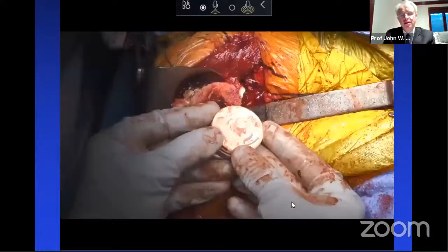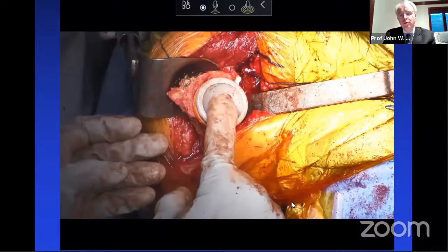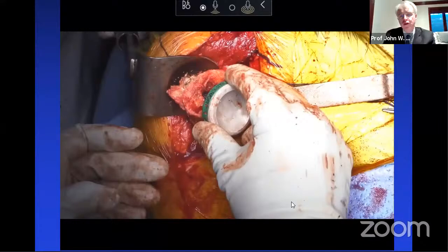This is the offset trays, as Professor O showed. This is a standard tray. You can see there how we have humerus above. The offset tray, this is a +3 offset, and then we'll go to a +6 offset, because usually the circle on the broach is on the inferior part of the humerus when we do reverse arthroplasty, so we get better coverage. And how about intraoperative motion?